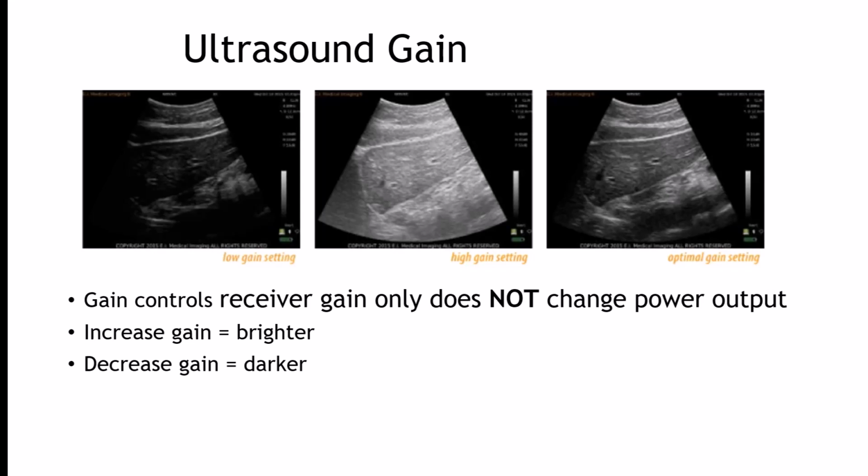All ultrasounds have gain control. It's often a knob, button, and/or a series of sliders on the console, and it's one of the most used and adjusted scanning parameters. Gain is a uniform amplification of the ultrasonic signal that is returning to the transducer after it travels through the tissue. So rather than brightening the monitor, the image on the screen is whitened by a uniform margin, as though the returning signal is stronger than it is. This makes it easier to see.